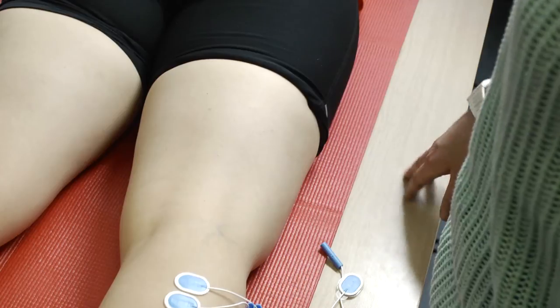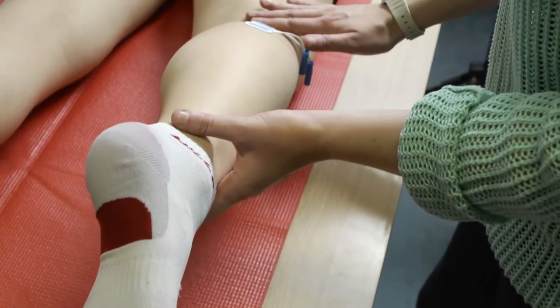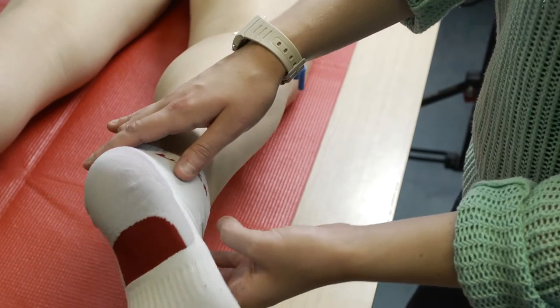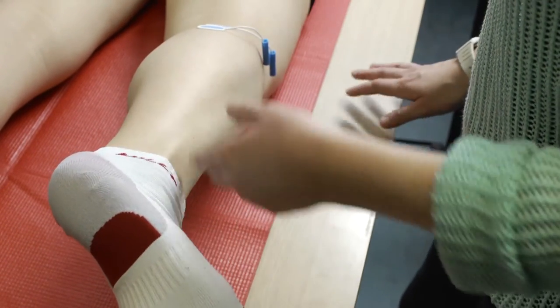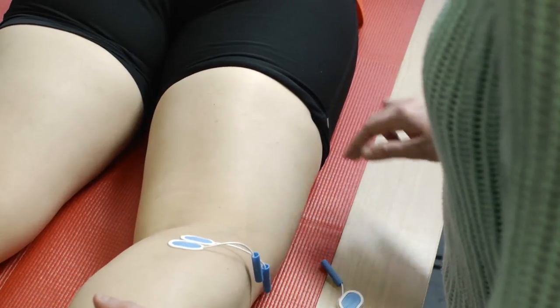So to look for this muscle, I'm just going to ask if you can flex your knee — that's great. Now if you turn your foot towards me, away from the other foot — that's perfect. Now I'm going to try and straighten your leg; I want you to try and resist me straightening it. Okay, that's perfect.